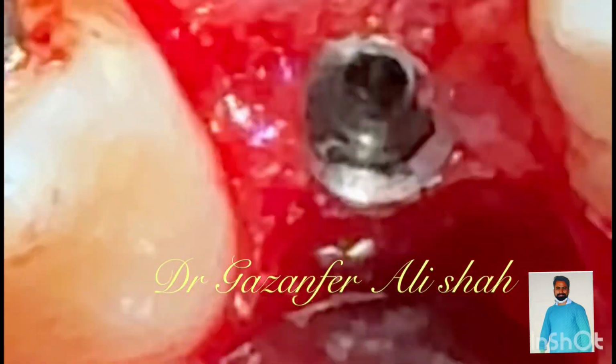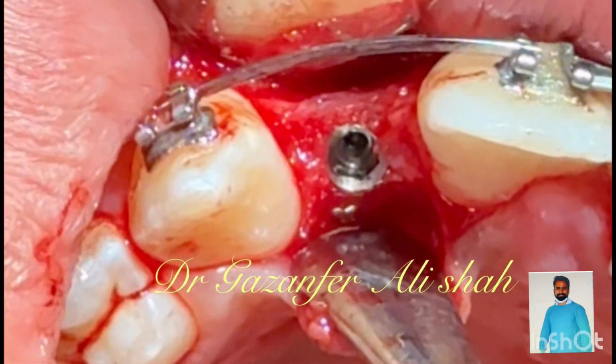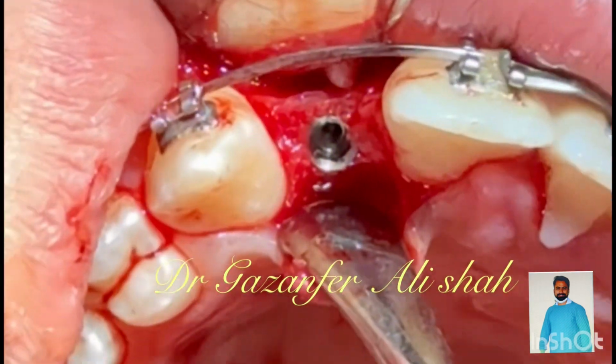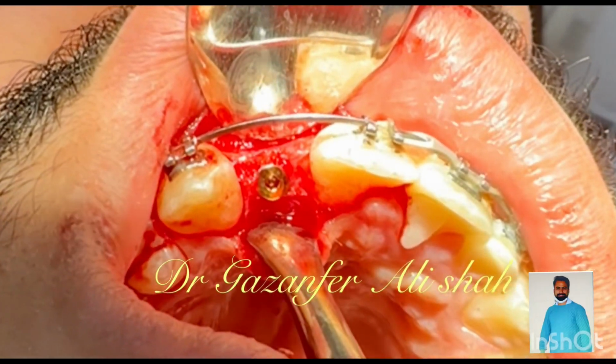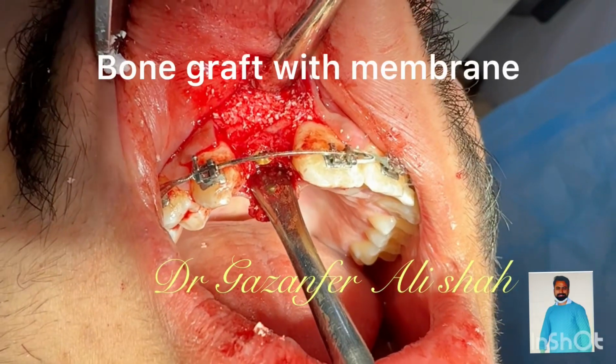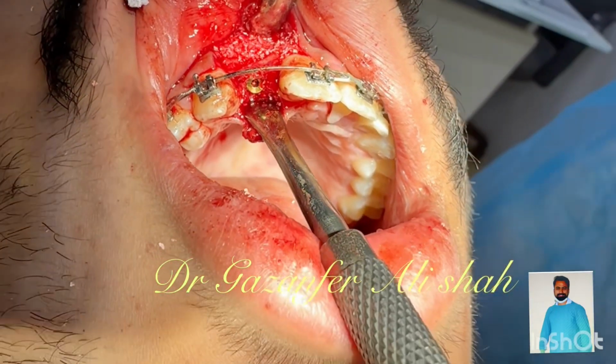You can check the occlusal view of the implant fixture. In this case, we have deficit buccal contouring at the apical area. We are augmenting this area with bone graft overlaid with membrane.